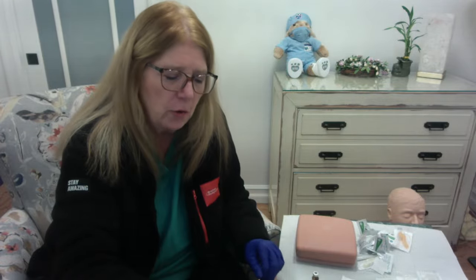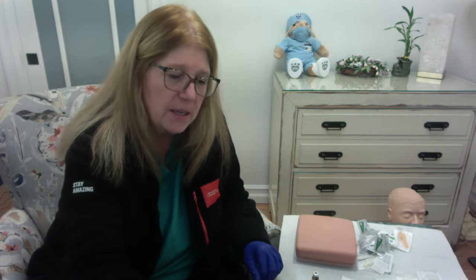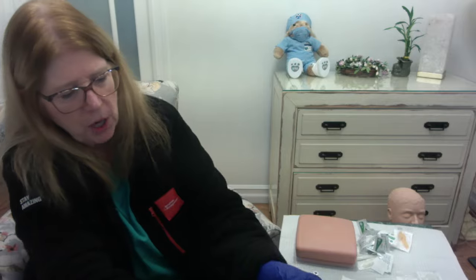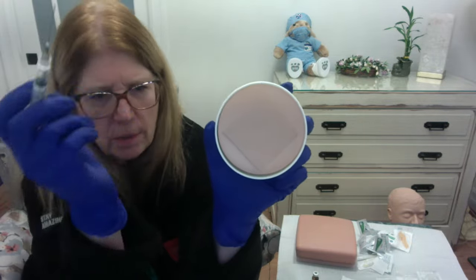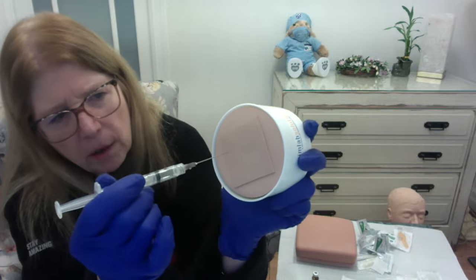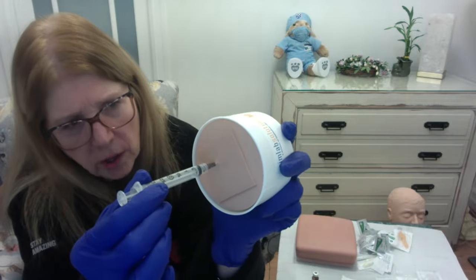I want to talk to you about something called the Z-track method. So there are some medications that are given IM that are extremely irritating, particularly to subcutaneous tissue. So I want you to kind of try to imagine something. I'm going to use this other small model here. Imagine that I'm giving an IM injection, right? I'm spreading the skin. I go in with this needle, right? I inject my medicine. I release the skin.